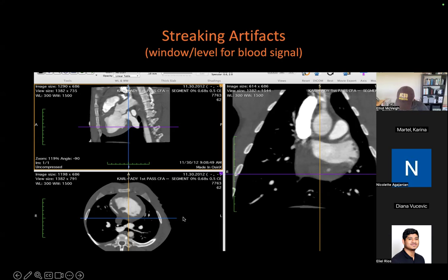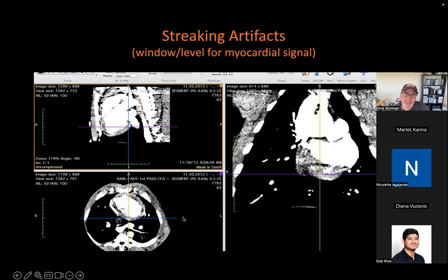And then as we look down at the signal in the myocardium, let's focus on the myocardial signal. We've centered and windowed so that the mean value of our displayed image is the mean of this myocardium. Then we open up the window to see details about the variability in brightness of this myocardium. We've lost any detail up here.